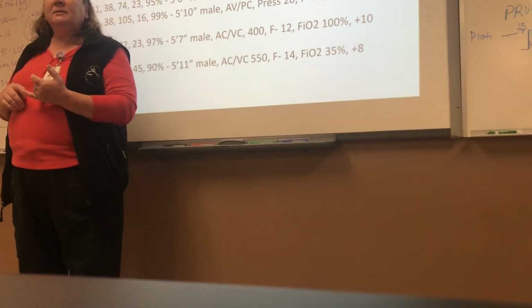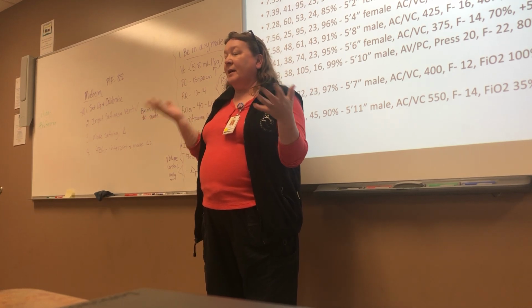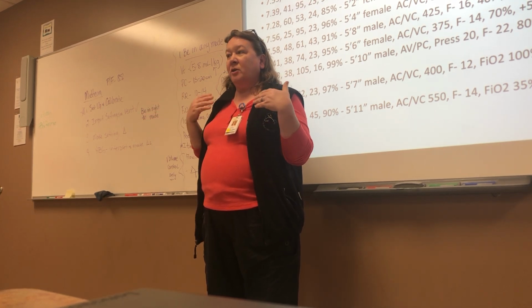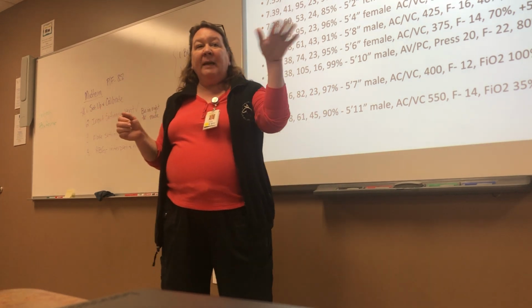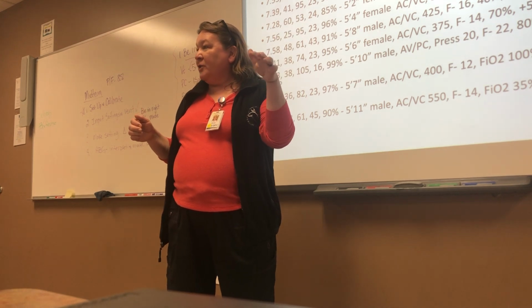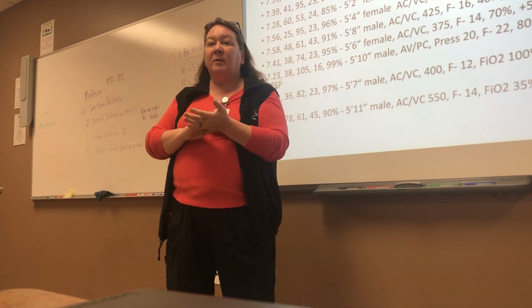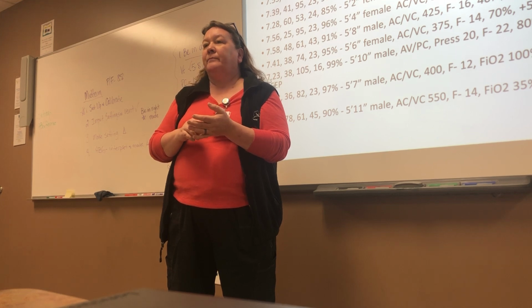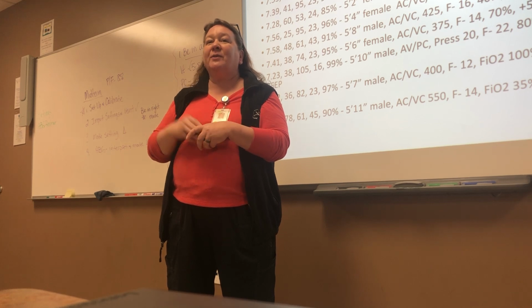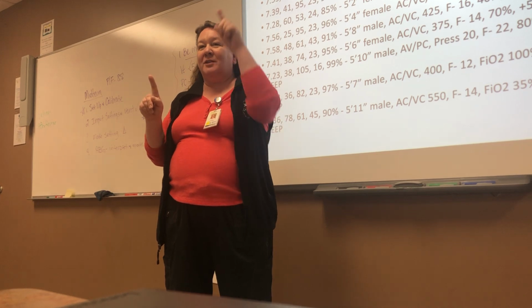The alarm settings. The thing with alarms is we're going to set them in the classroom at certain parameters, and they're literally just the numbers on your slick that you have. You look at the median, like the average range of what your patient's doing, and then you go above and below that. So if you look on your slick, it'll tell you tidal volume alarm is 100 above, 100 below. If it's 3 digits, it's 100 above and below. If it's 2 digits, it's 10 above and below. And if it's 1 digit, it's 2 above and below.